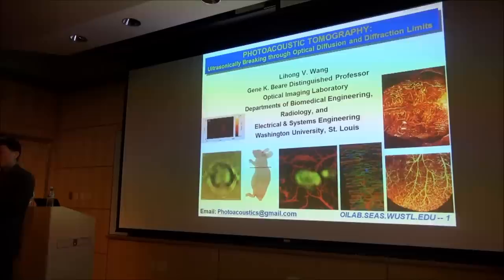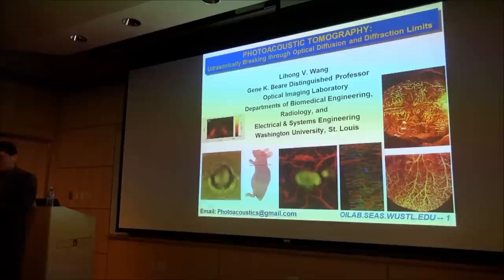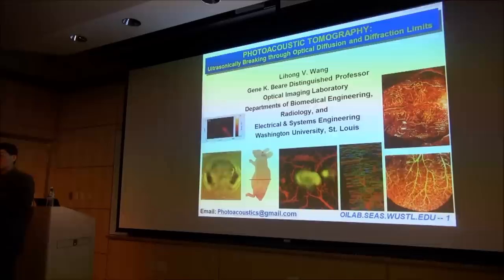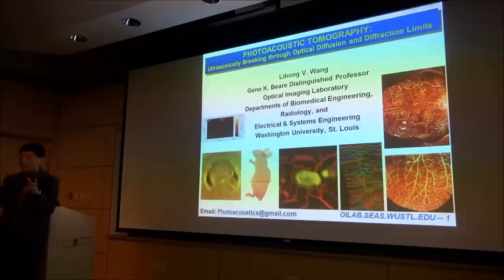So it's very different from X-ray. As X-ray goes through tissue, it becomes hardened. But ultrasound becomes softened, in a way. So the longer the distance you propagate, the narrower the band. The rule of thumb is 30 megahertz-centimeters. So the frequency-depth product is roughly a constant in soft tissue. For example, 3 megahertz corresponds to 10 centimeters. All right. So that product is roughly constant.